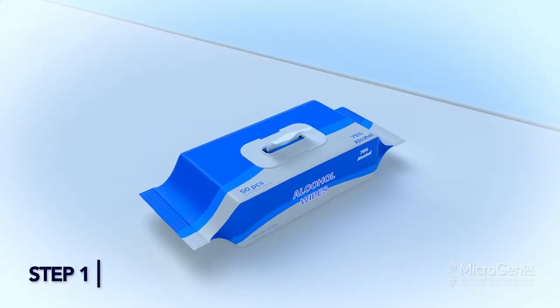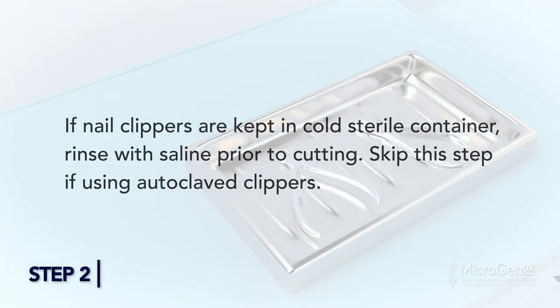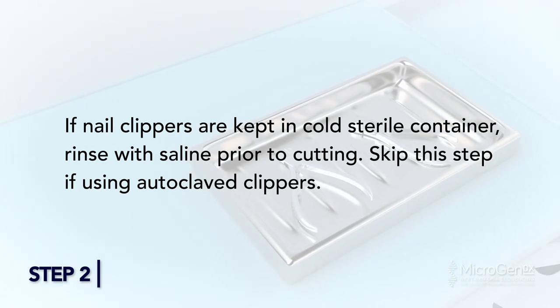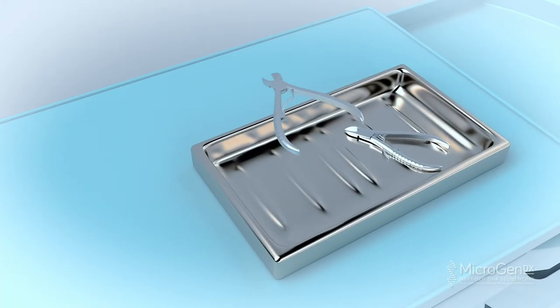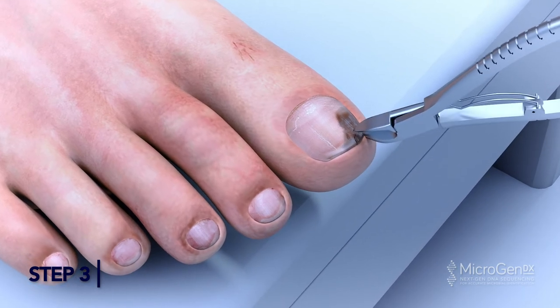Clipped Nail Method. Step 1: Clean nails with alcohol wipes. Step 2: If nail clippers are kept in a cold, sterile container, rinse with saline prior to cutting. Skip this step if using autoclaved clippers. Step 3: Clip the nail as close to the discolored area as possible.